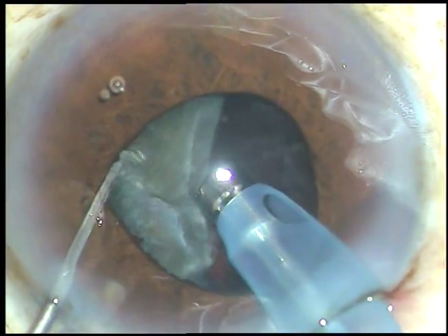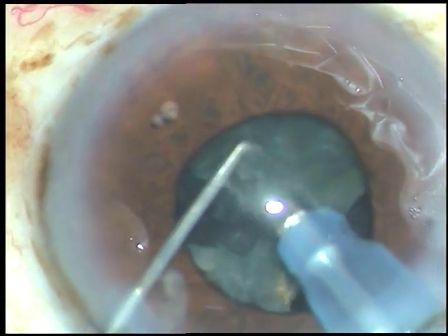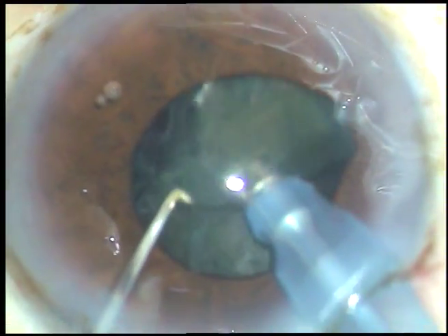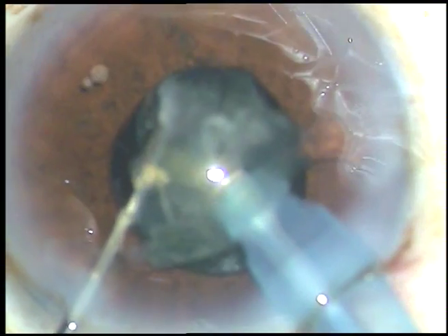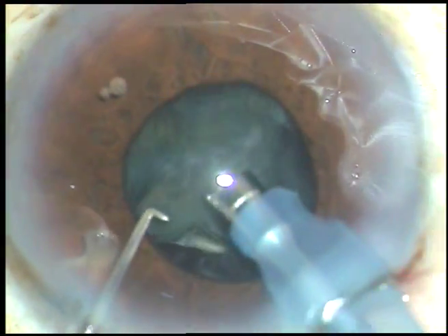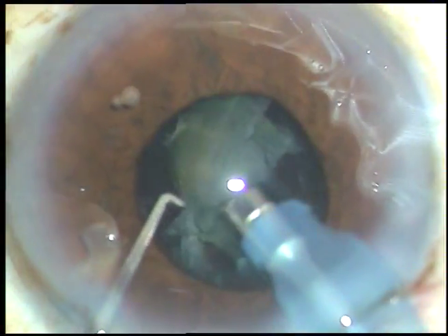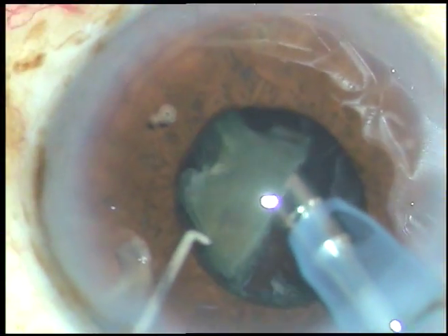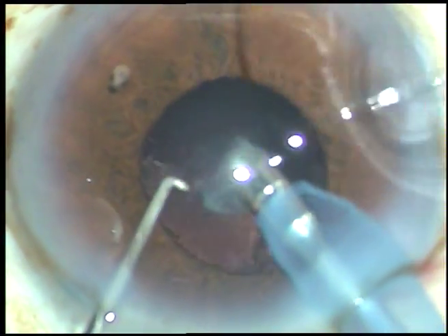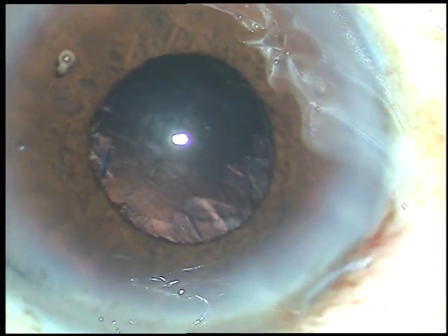And this is one half nucleus — it is held and it is chopped like this. I was fortunate to have a brittle nucleus in this case. And see, this time the pupil has become really small — it is about three millimeters in size. I am staying right at the center of the pupil and emulsifying the fragments.